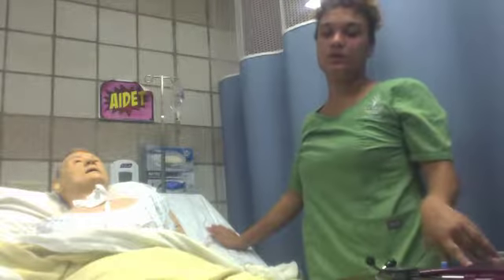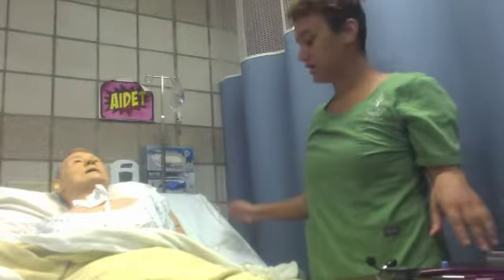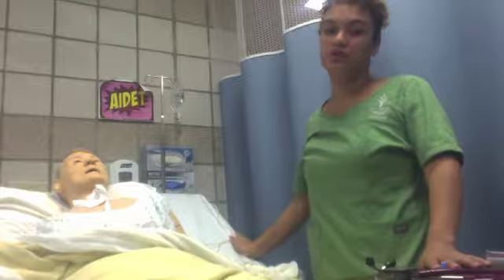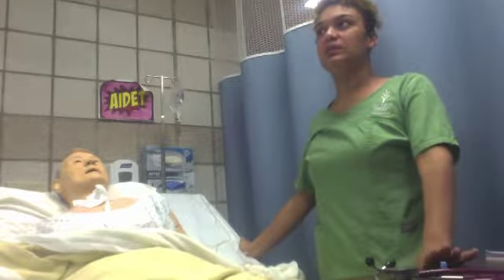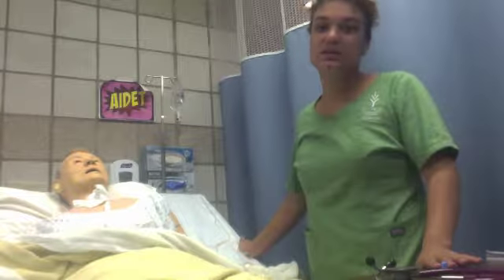This video is for checking IV site and IV therapy. To begin, I'm going to check for the order, the appropriateness of the therapy and the meds. I'll be checking any inconsistencies that I may have seen.